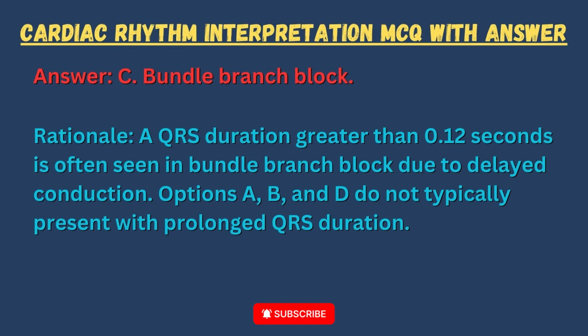Answer: C. Bundle branch block. Rationale: A QRS duration greater than 0.12 seconds is often seen in bundle branch block due to delayed conduction. Options A, B, and D do not typically present with prolonged QRS duration.